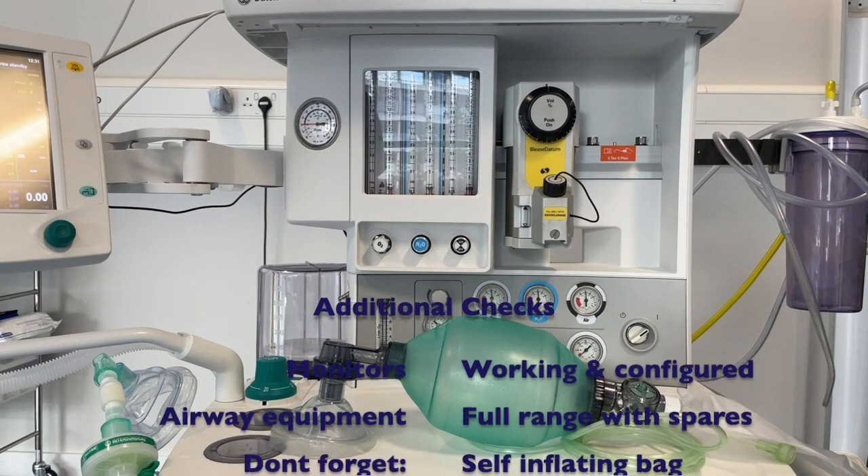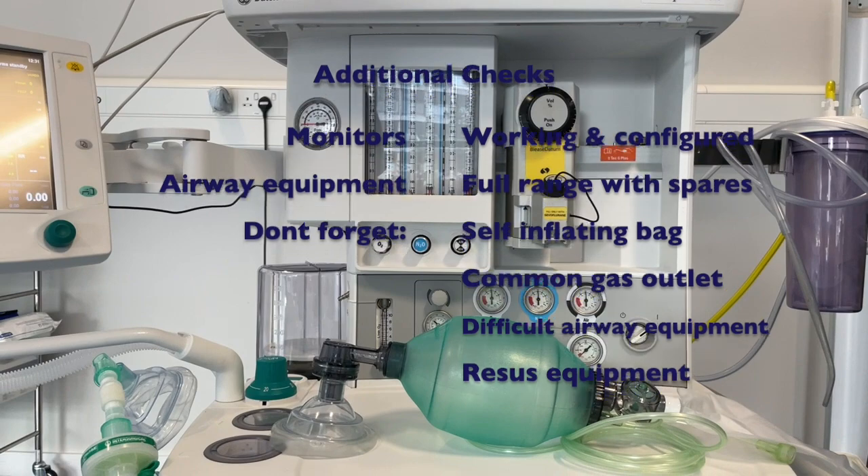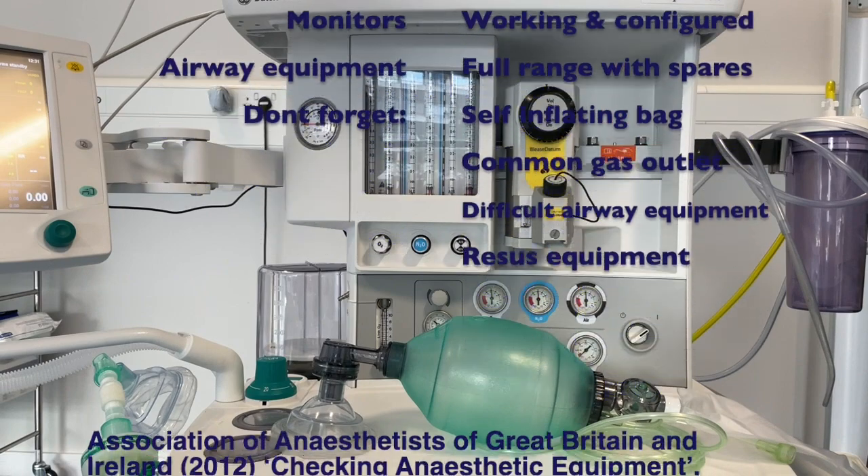That brings us to the end of our anaesthetic machine checklist. But don't forget the other pieces of anaesthetic equipment that need to be checked before you start your list.